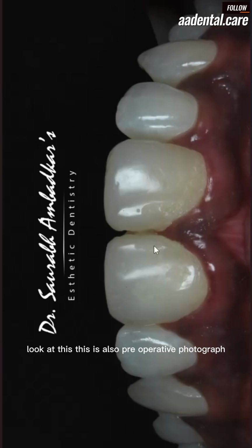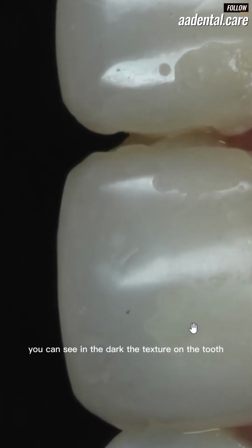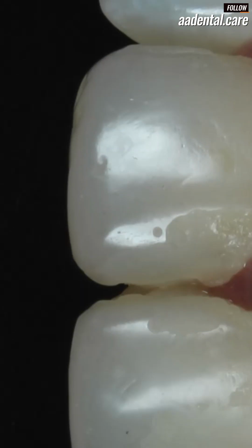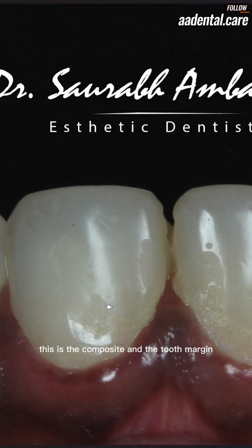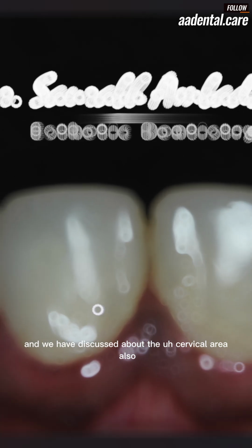Look at this. This is also a pre-operative photograph. You can see in the dark the texture on the tooth. There is no proper contouring of the tooth, no proper finishing and polishing. Here you can see the inner tooth. This is the composite and the tooth margin. This is also composite and the tooth margin. And we have discussed the cervical area also.